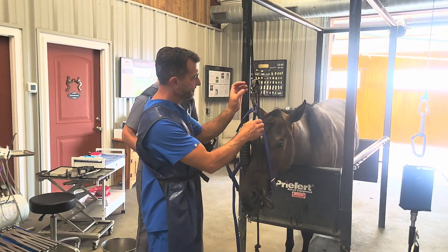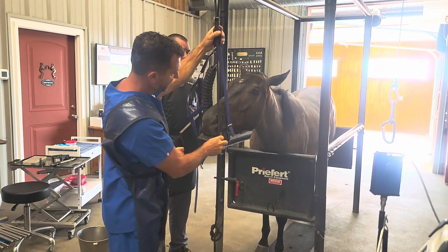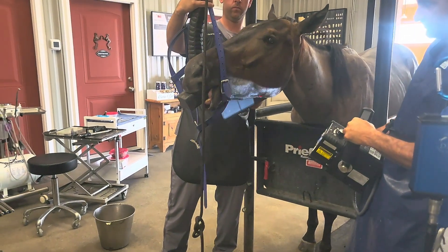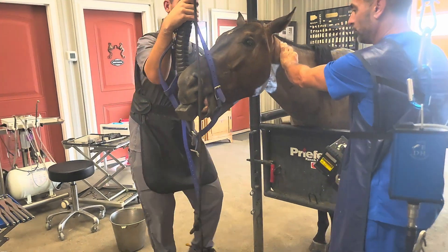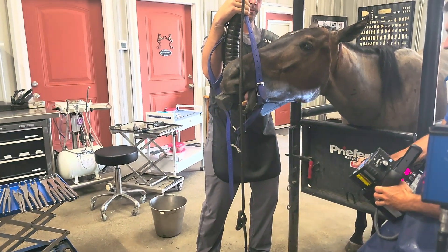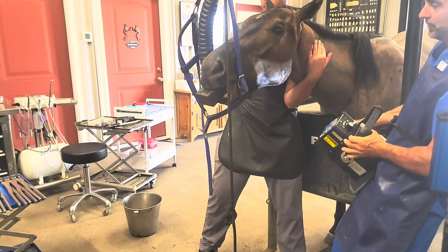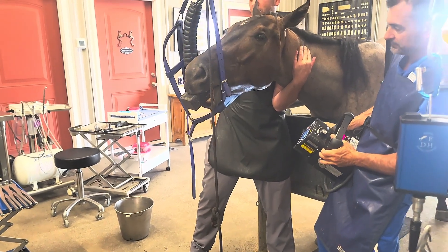We've got the block in the mouth and I'm using a dental halter, offsetting it slightly and pulling the head up a little. We're going to come over to the side. Remember I'm going to be slightly caudal to rostral to account for the separation of the quadrants as we go further back in the mouth. The plate is down here — the horse is a bit mobile so we have to account for that. We start straight lateral, drop down ventral about 45 degrees, then add slight caudal-to-rostral angle.